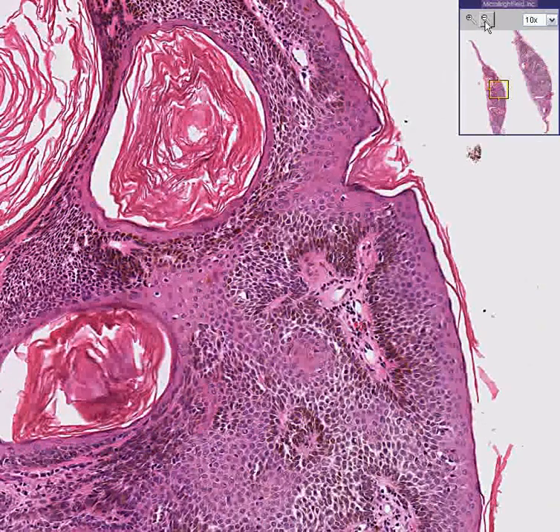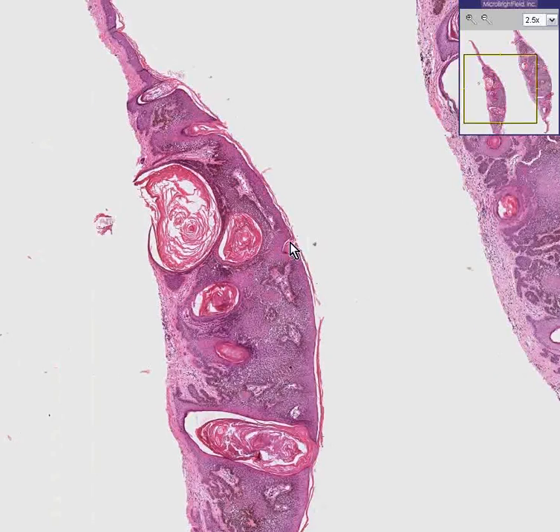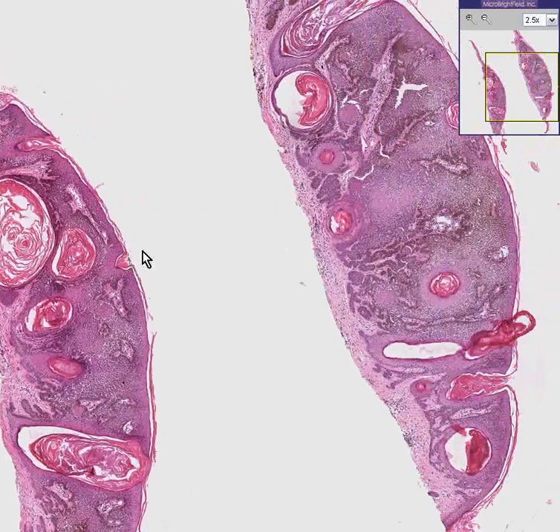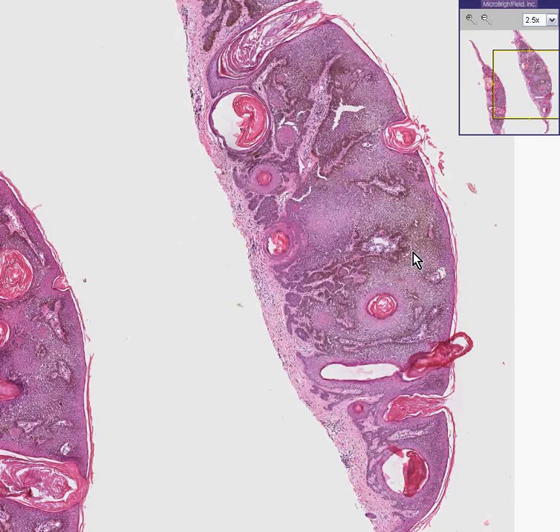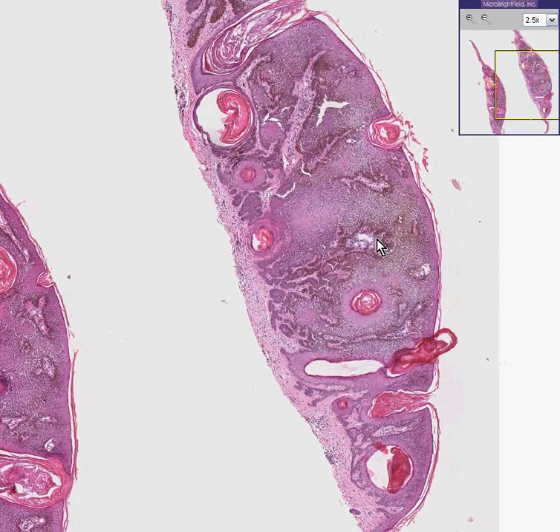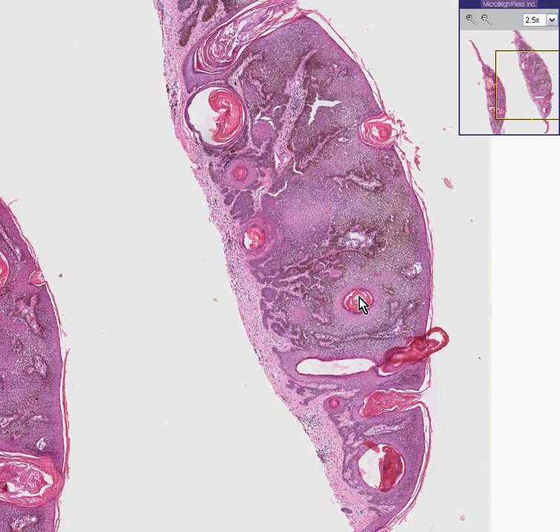Classic, textbook, drop dead easy, slam dunk seborrheic keratosis. This is not caused by or related to sun exposure like actinic keratosis. This is related to just proliferation of the epidermis forming these invaginated cysts.